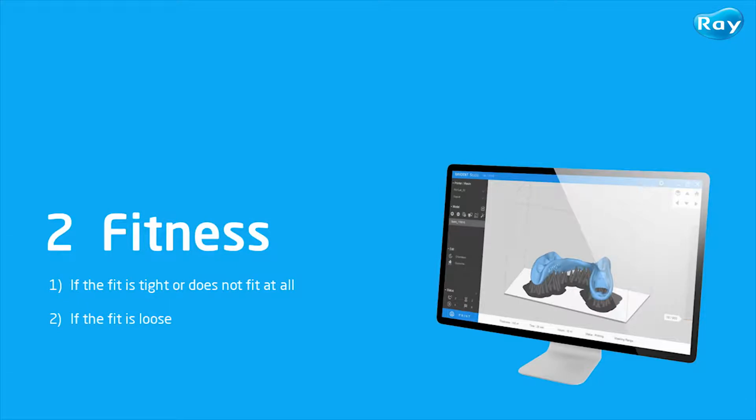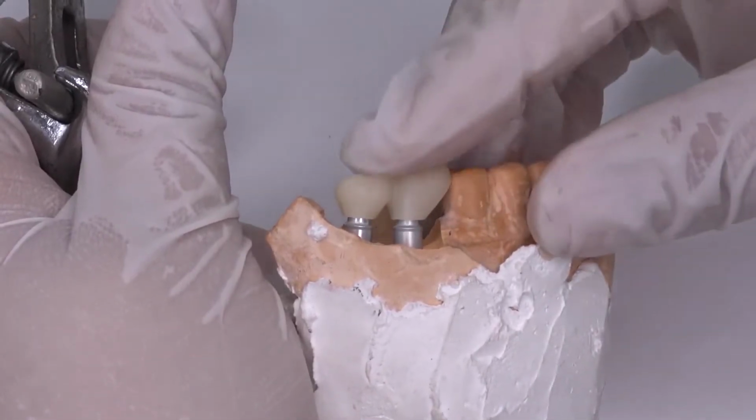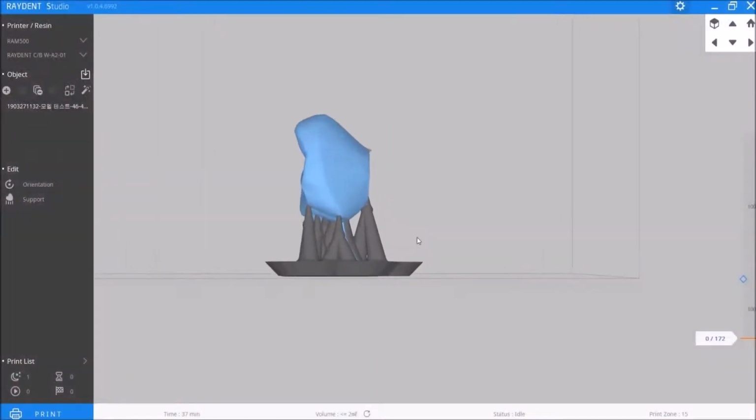The second chapter is about print fitness. Let's see causes and troubleshooting in each situation. If the printout fits tightly or doesn't fit at all, you should check the print direction or parameter values. For example, this 2-unit implant bridge has support on the lingual side and the angle was almost 90 degrees from the surface level.